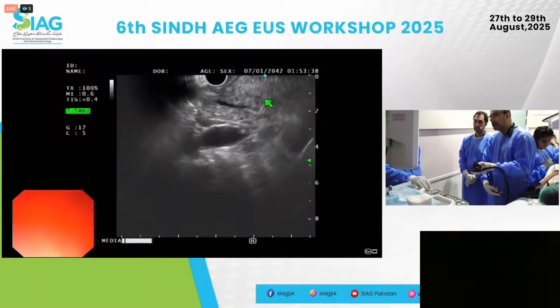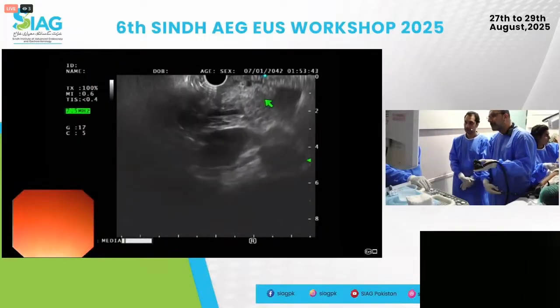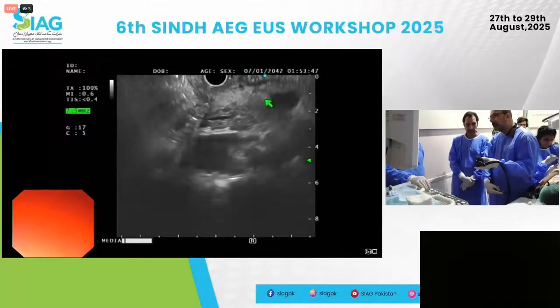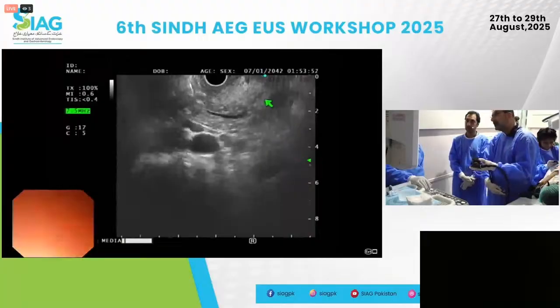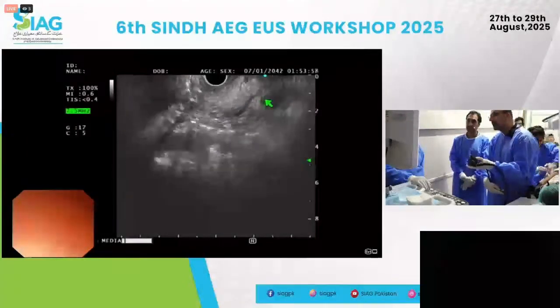So PD, go counterclockwise, get bile duct. If I wanted to follow bile duct, keep going counterclockwise. But this is also where you'll fall. So to try and avoid falling, I may push forward, go clockwise again, and there's my PD. Now I'm following the PD from the head down towards the dorsal.